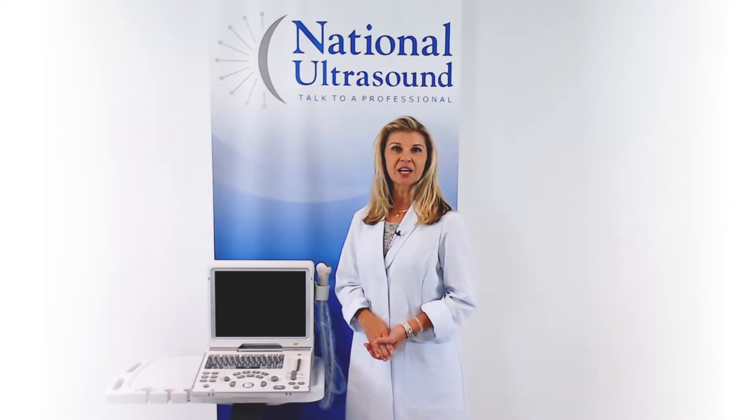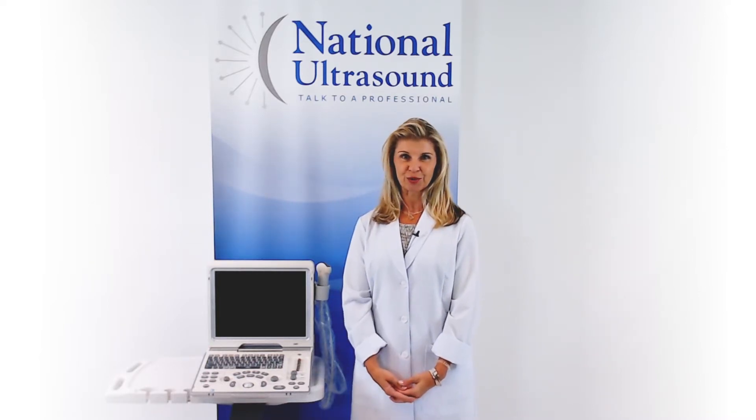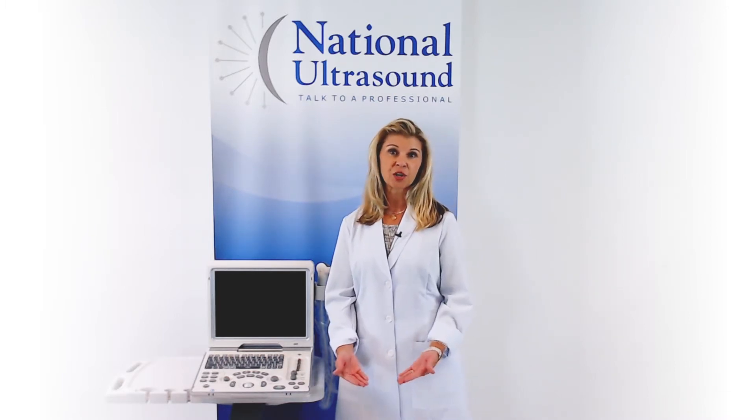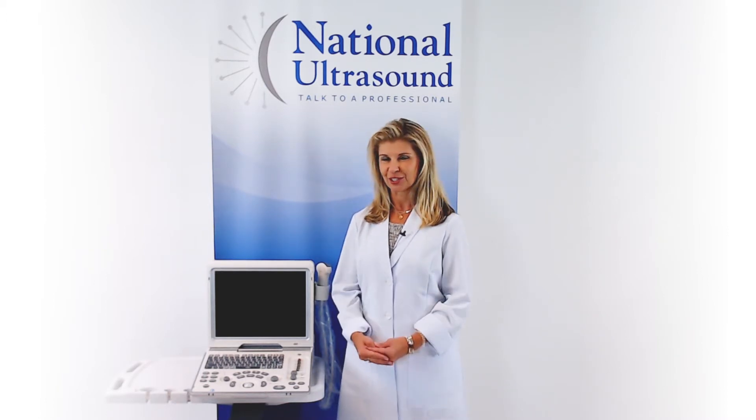The Mindray Z6 provides excellent quality imaging while staying within your budget. The Z6 portable ultrasound machine is a well-balanced choice for those who require the value of a quality color doppler ultrasound without the budget constraints.